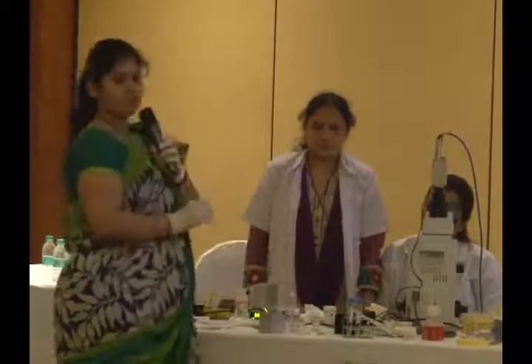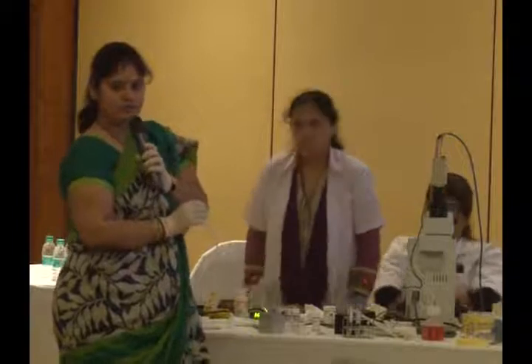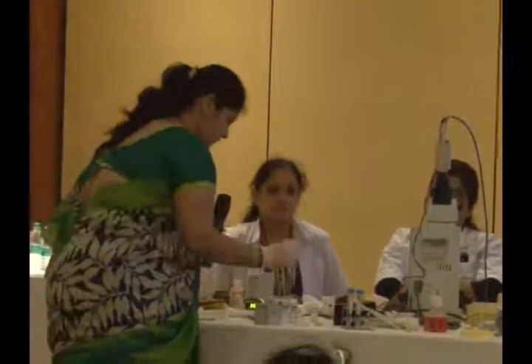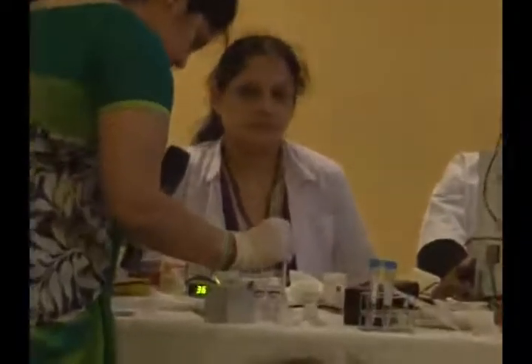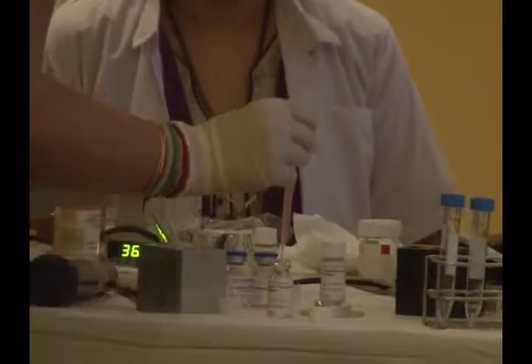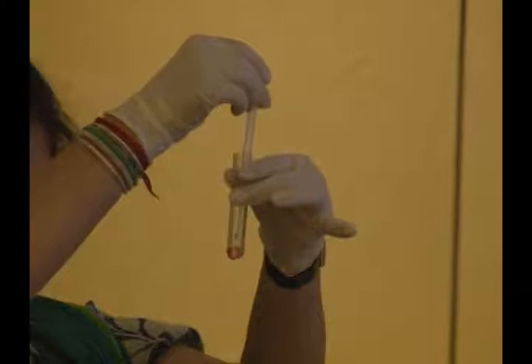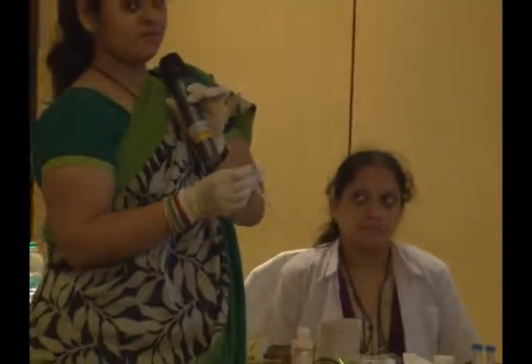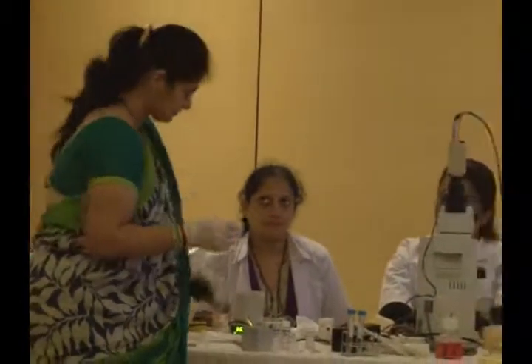See, it's always 1:2 when you do swim up. If you have 1 ml of the sample, you take 2 ml of the medium. Avoid air bubbles because bubbles are always trouble in IVF.